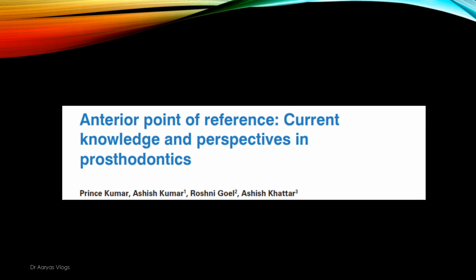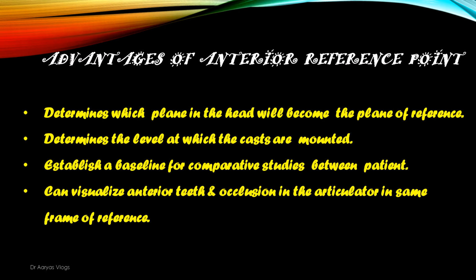According to an article, Anterior Point of Reference, Current Knowledge and Perspectives in Prosthodontics by Kumar et al., the advantages of anterior reference points are it determines which plane in the head will become the plane of reference.